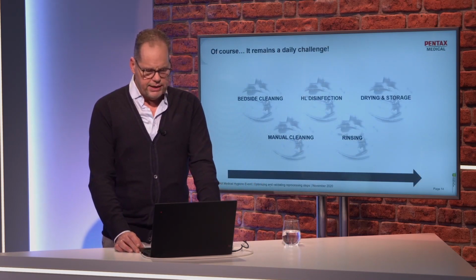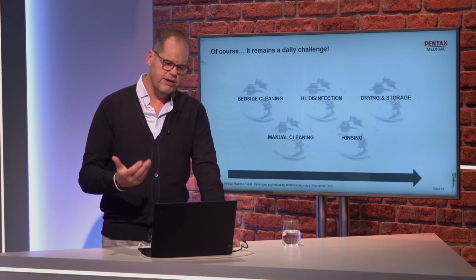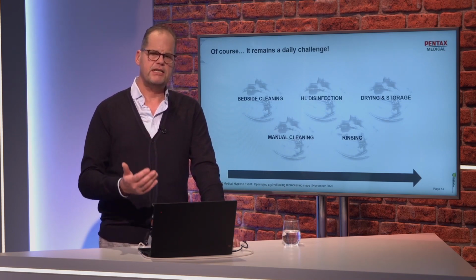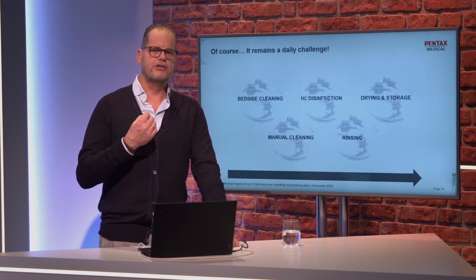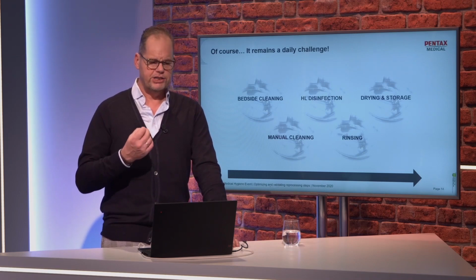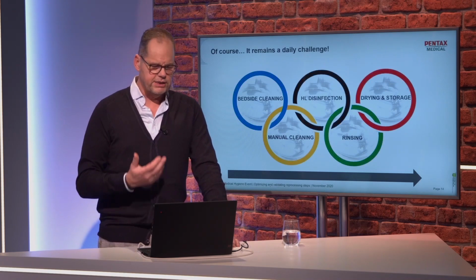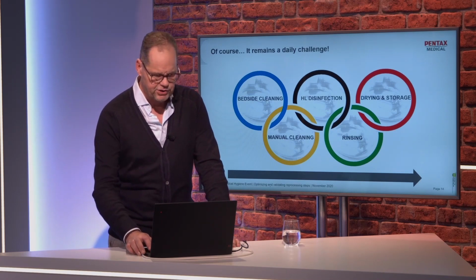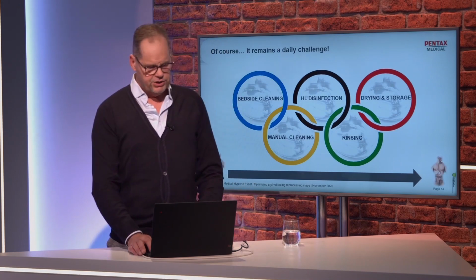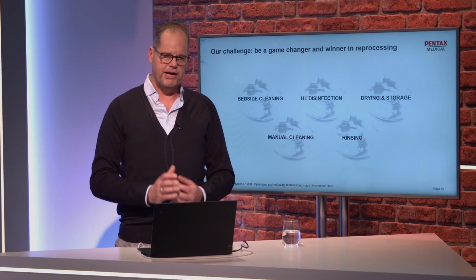And of course, as we also discussed in the previous presentation, it remains a daily challenge. It's the bedside cleaning. It's the manual cleaning. It's the high-level disinfection. It's the rinsing. And it's the drying and storage. It's a daily challenge. And yes, it's an Olympic game. It's an Olympic challenge, which you have to do to prevent the transmission of microorganisms to the next patient.